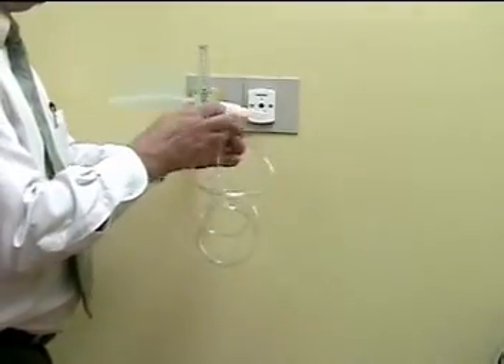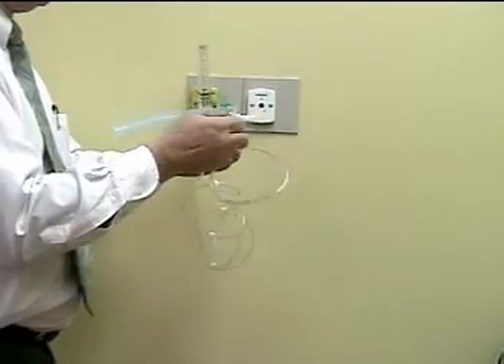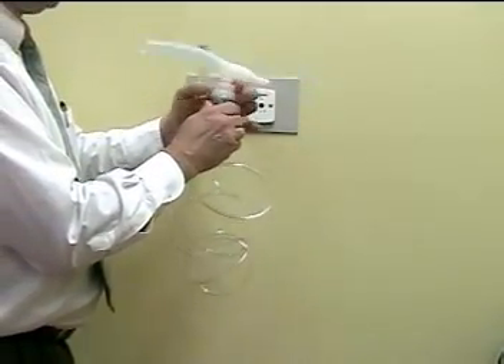Open up your nebulizer, add your medications, then connect the lid of the nebulizer back on.